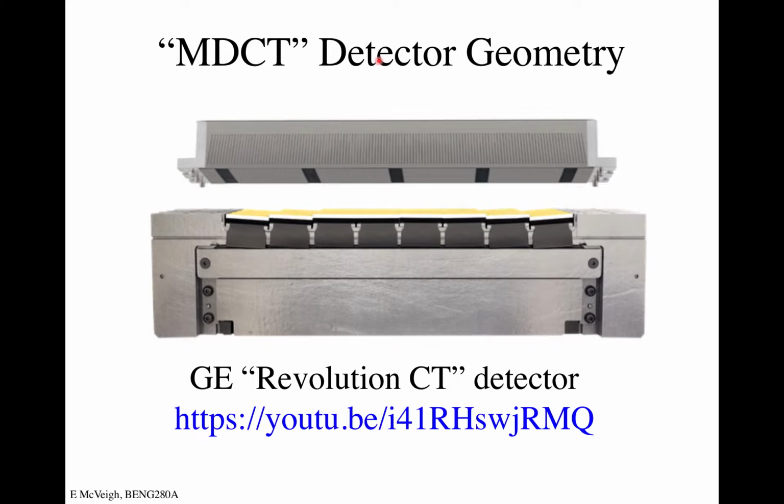It never just goes straight through. You don't really see an image from photons that have gone straight through. It's kind of the same thing with X-rays, except a lot of them go straight through and some of them don't. Some of them make that image the flashlight does, just a fuzz, because they're bouncing off things and hitting the detector from a different angle, right?